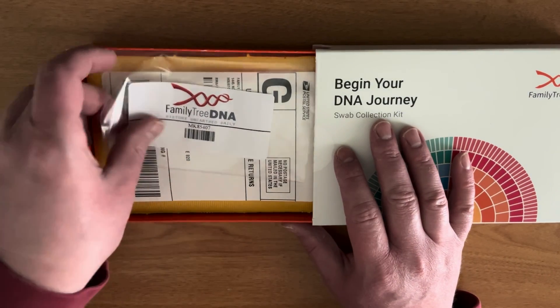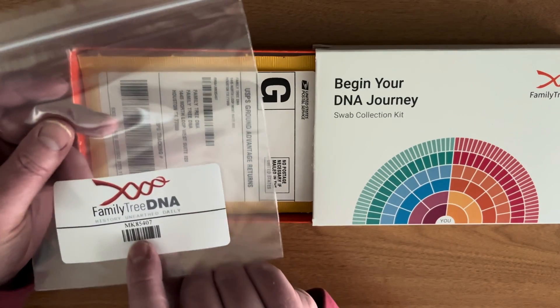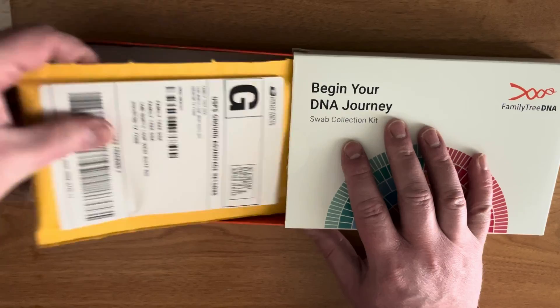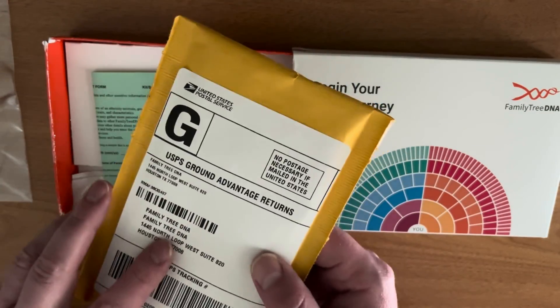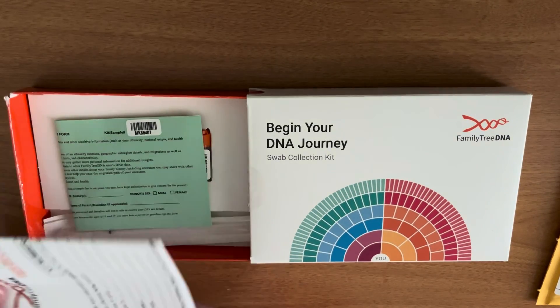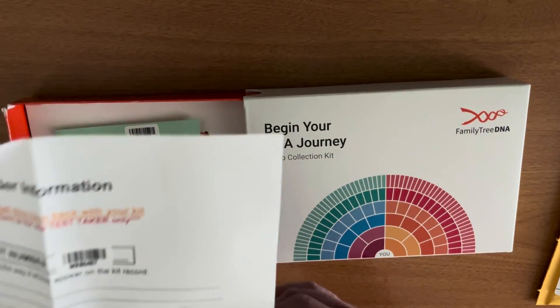Let's see what else is in the box. We've got a bag that's going to be required for sending back the samples — it's got that same barcode, number MK85407, so make sure those match. We've got a prepaid shipping envelope that's going to send your samples back to the company. We've got the order information form.